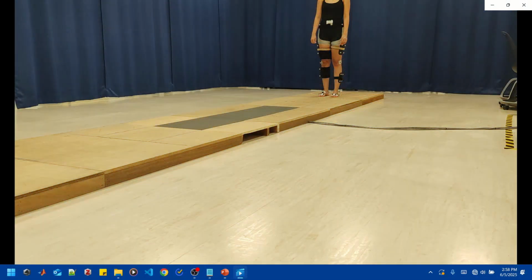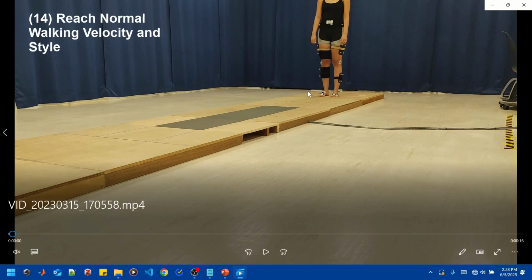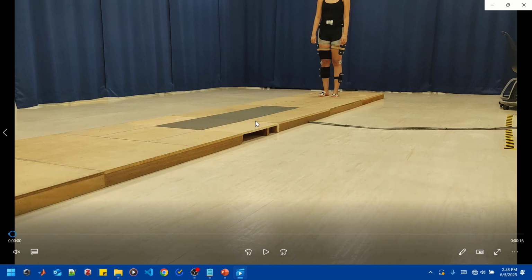Right. So number 14 is to let your subjects start moving a little bit behind the capture volume so that by the time they reach the capture volume, they would have reached their normal walking velocity and pattern, unless of course you are analyzing the start of the motion. With this, you should also start your recording, wait for a few seconds, and then instruct your subject to start moving so that your equipment has some time to normalize.